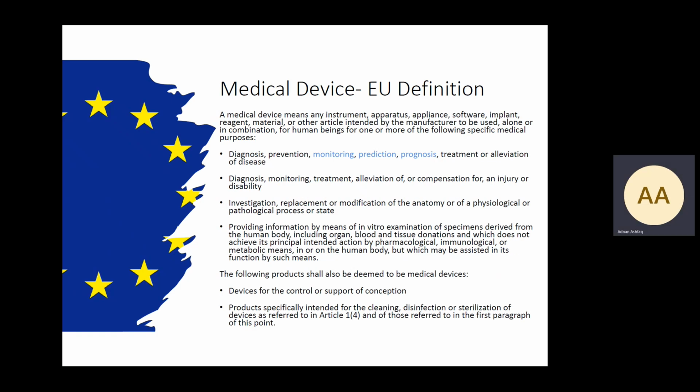If we briefly look at the medical device definition from the EU perspective and the US perspective, we'll see three terms are missing in the FDA definition.